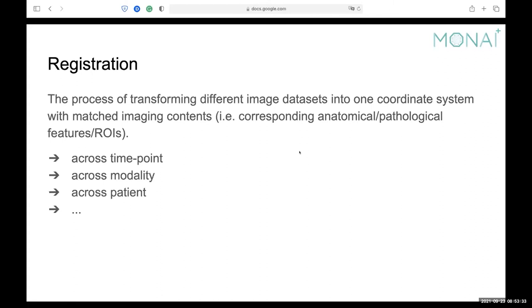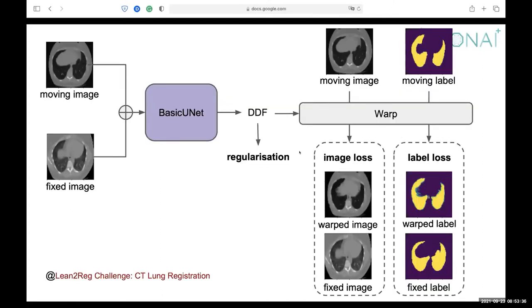For a more detailed example, here we can see a tutorial we have implemented in the MONAI tutorials, which is about registering lung CTs. For registration defined as a task, we usually have two image inputs: one is the moving image and one is the fixed image. We are trying to predict a deformation to match the moving image into the fixed image coordinates. In this example, we are registering lung CTs from the same patient — one at expiration and one at inspiration.